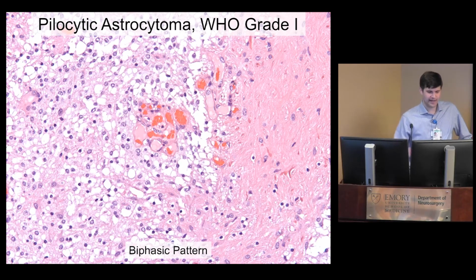That generally refers to some type of ground substance deposition in that area. Ground substance looks bluish under the microscope on an H&E. But you'll see more oligodendroglial-looking cells in this area, very rounded tumor nuclei. And if you get a small sample of this, you can get tricked into thinking that it is actually an oligo, but close examination can usually help you out.